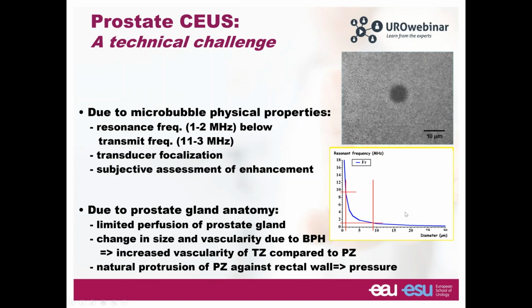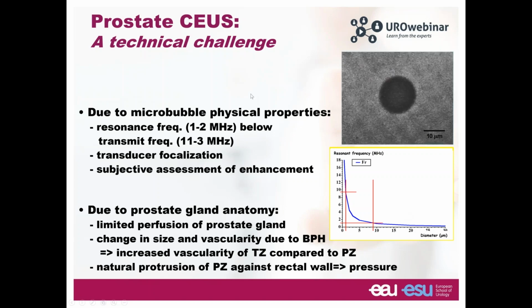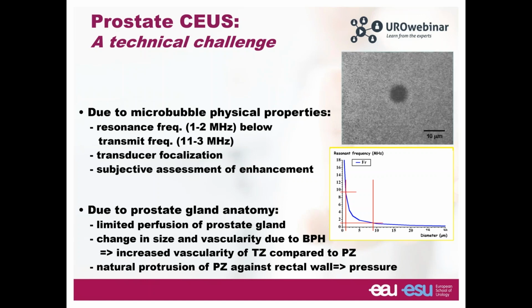So these microbubbles are oscillating inside the blood pool, and this is how they increase the backscatter signals to the transducer, and they can even produce frequencies that are not in the transmit pulse.